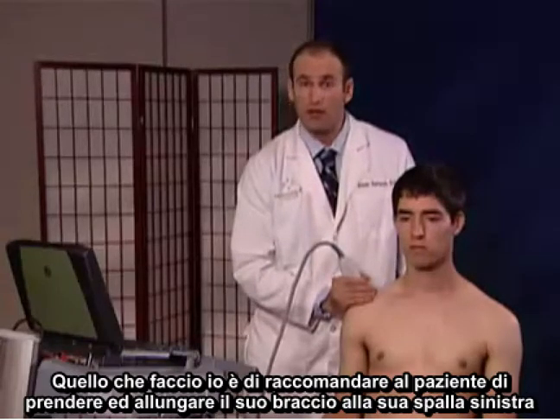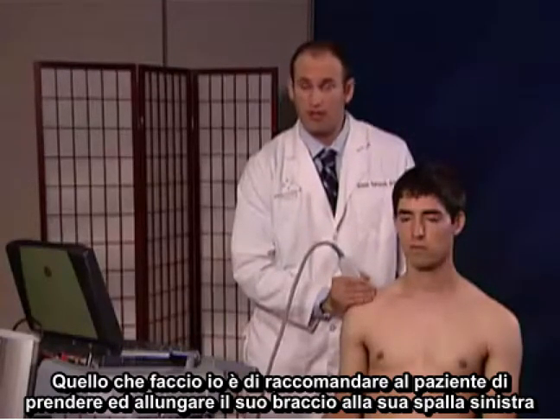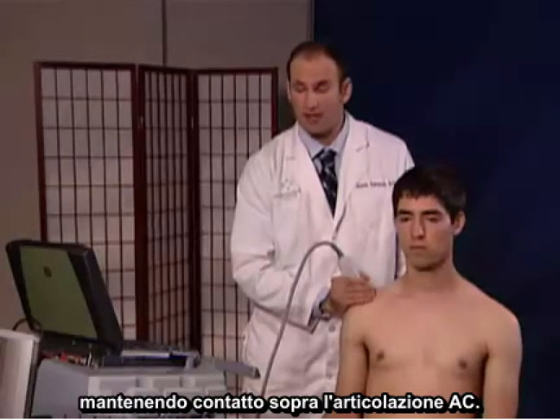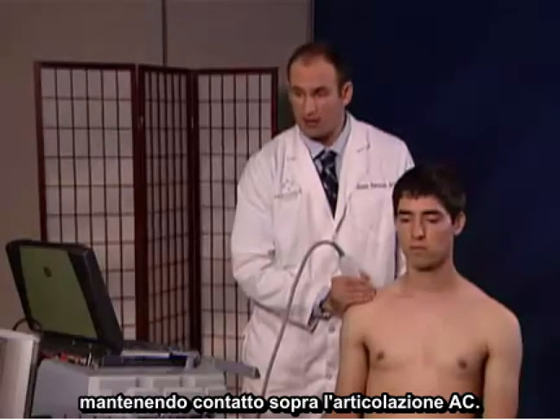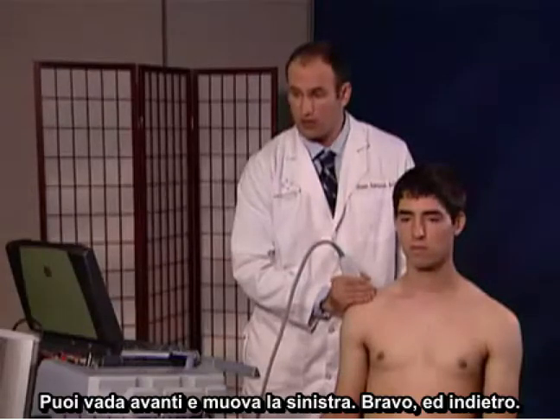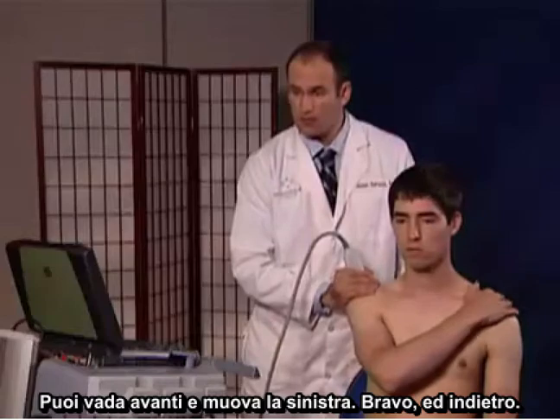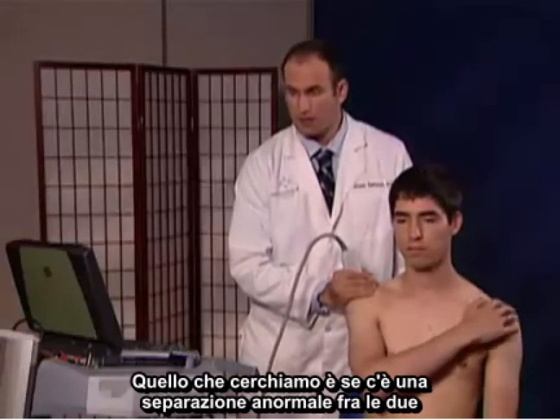What I do is recommend the patient slowly take his right arm and reach it across to his left shoulder while maintaining contact over the AC joint. Go ahead and slowly move — great, and back.